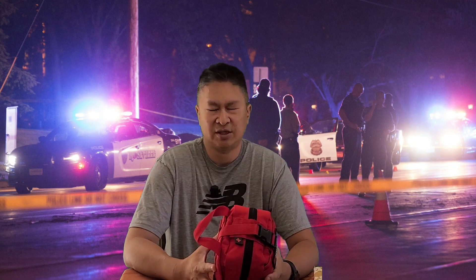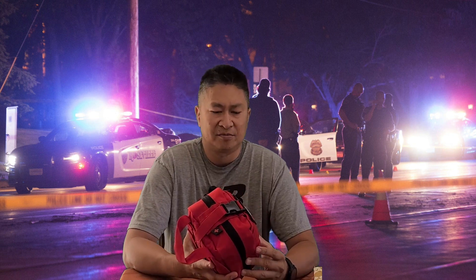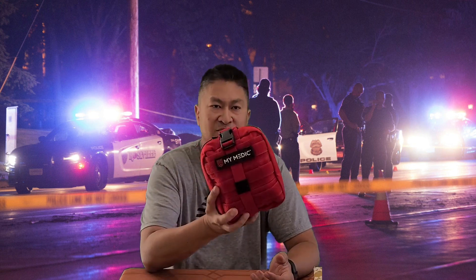A lot of people think preparation is kind of like being paranoid or something, but so many things have been going on — even simple things. You have a headache, you have a small cut, your kids have a cut. It could be just a little bit farther away from emergency services, so it's good to have something you can work with in the meantime. That's why I got this MyMedic kit.